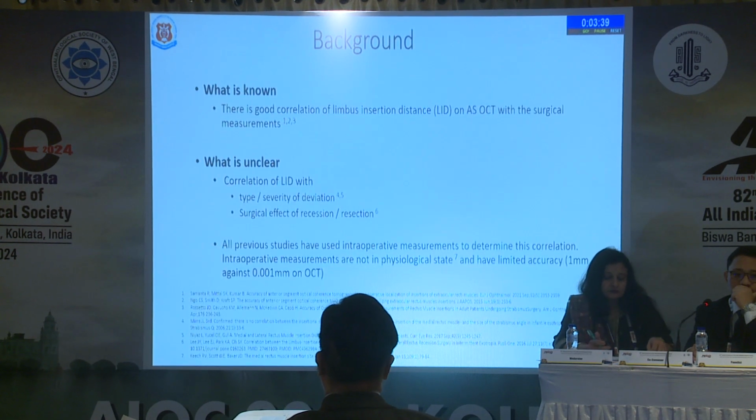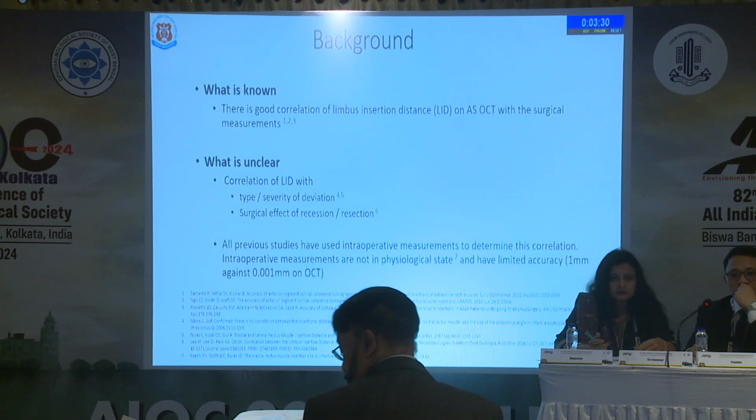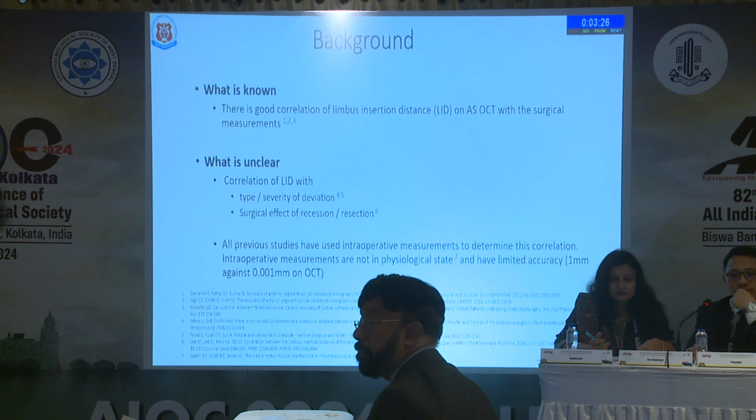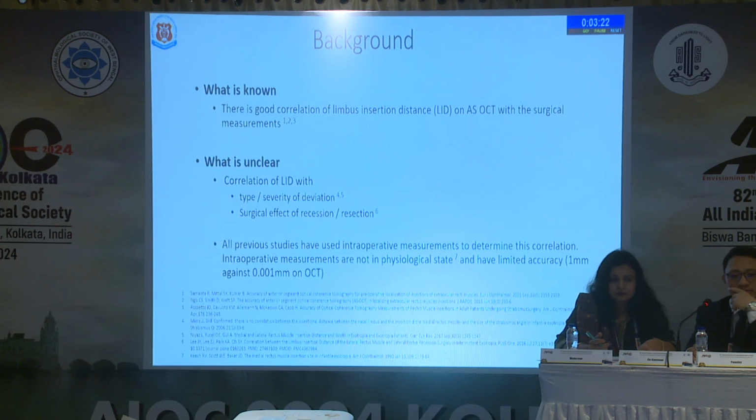What is known: there is a good correlation of limbus insertion distance on ASOCT with the surgical measurements. But what is unclear is the correlation of limbus insertion distance with type or severity of deviation or surgical effect of recession or resection. All previous studies have used intraoperative measurement to determine this correlation. Intraoperative measurements are not in physiological state and have limited accuracy.